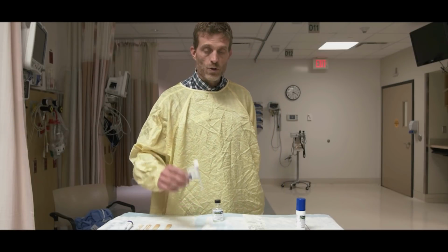I have done some recent reading, and it looks like with a really low flow rate, so we had that flow set at 4 liters per minute, the particles generated are larger and some of them may preferentially rain out in the upper airway. The other thing that was interesting was the faster the inspiration, the more that rains out in the upper airway. So I just kind of wanted to try it. Chad said he got a little bit of numbness to the back of his tongue with that. But in comparison to the atomizer, there was no comparison. So again, I'm going to go back to my practice of generally not using the nebulizer at all.